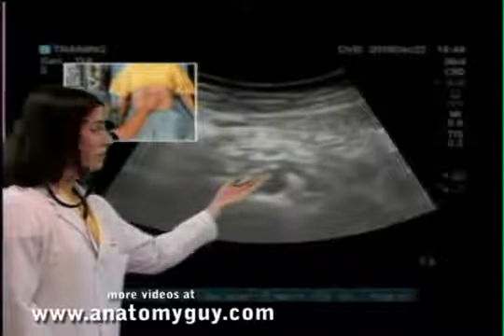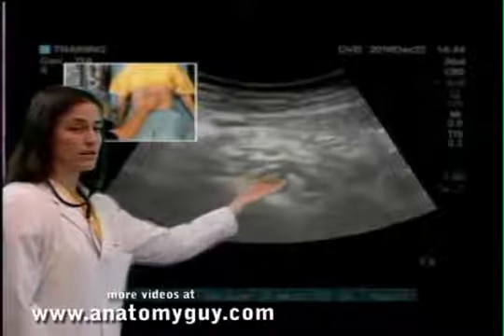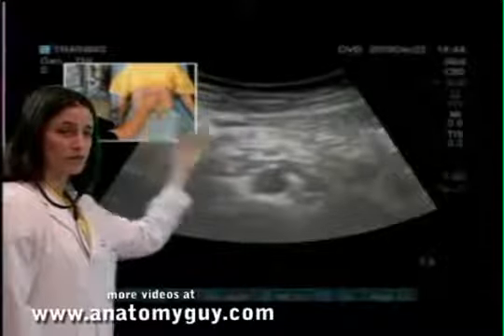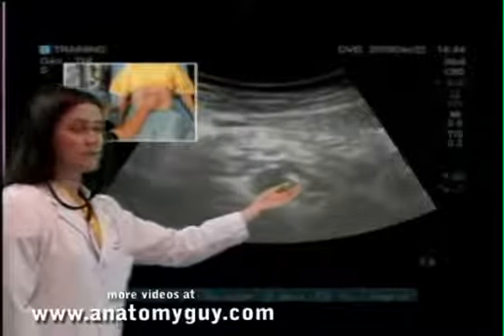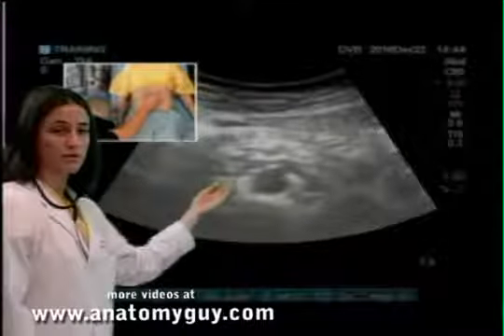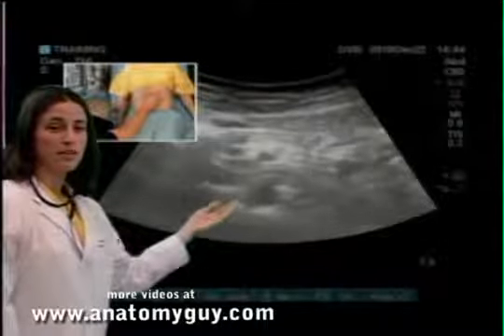With the celiac trunk coming off, this side of the screen is actually the patient's left, since our probe marker is pointed to the patient's right from earlier. On this side of the screen, the patient's left, is the splenic artery coming off and the common hepatic vessel coming off here. We're going to scan towards the proximal aorta.